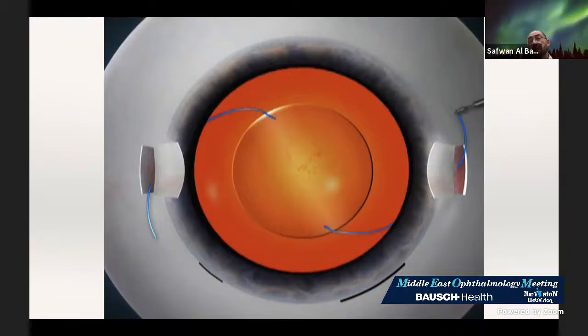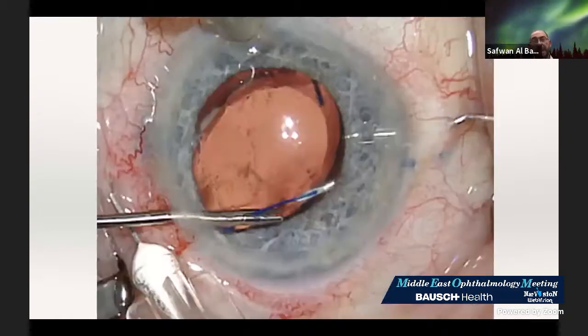There is no tunnel, and I'm just fixing the four eyelets in a horizontal way, so the chance of tilt is minimal in this technique. And again, for the Yamani, I will show you tips in my technique not to use double needle.